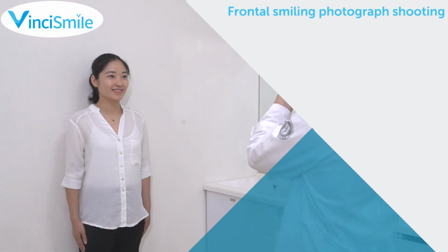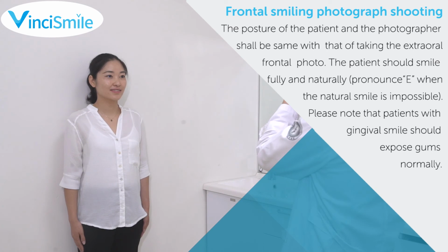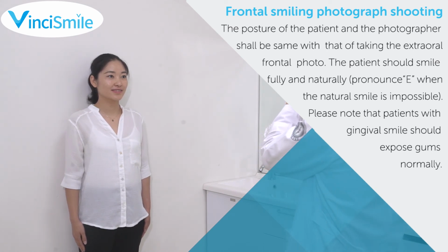Frontal smiling photograph shooting. The posture of the patient and the photographer should be the same with that of taking the extra-oral frontal photo. The patient should smile fully and naturally. Pronounce E when the natural smile is impossible. Please note that patients with gingival smile should expose gums normally.